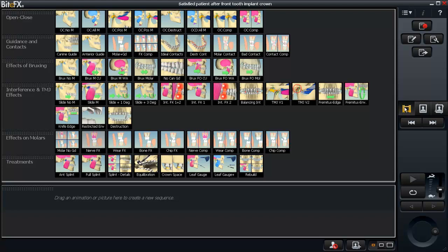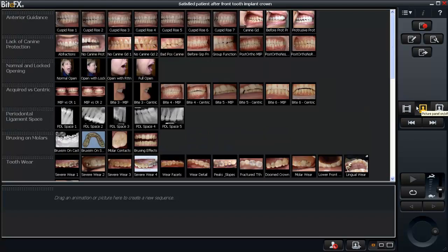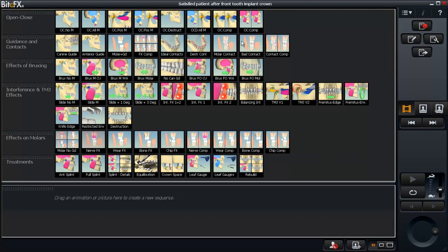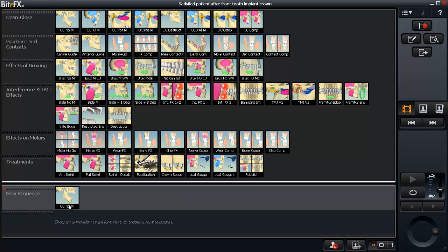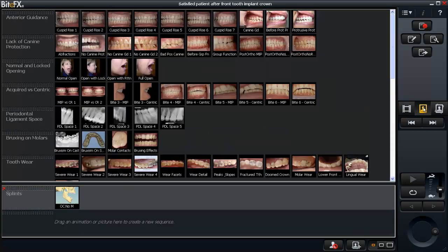I'm going to go through the simplicity of using BiteFX and just familiarize you with the buttons that are important to get started. So as I said, you have pictures and you have animations. This particular sequence is going to involve several animations, which I'm just going to simply grab and drag down here to where it says 'new sequence.' I'll double-click here and we'll call this 'splints.'